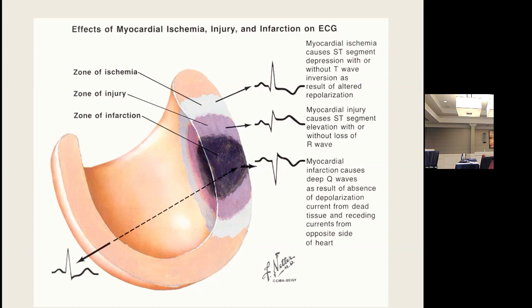It's not that you're generating force. It's like you're looking through, and they have to be wide enough and deep enough and in the right distribution to make a diagnosis. So 2 or more, 1 millimeter wide, at least 1/3 to 1/4 the height of the R complex for them to be meaningful. And that's the diagnosis of infarction. And infarcted tissue, unfortunately, doesn't come back. It's dead tissue. And the whole name of the game here is to try to prevent it.